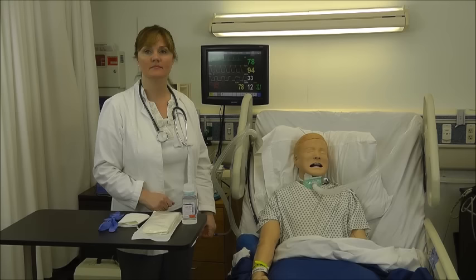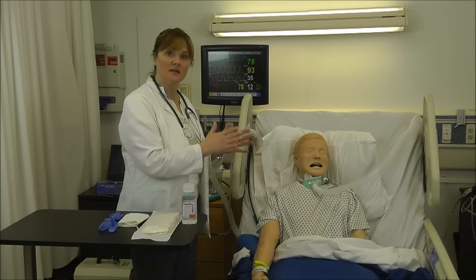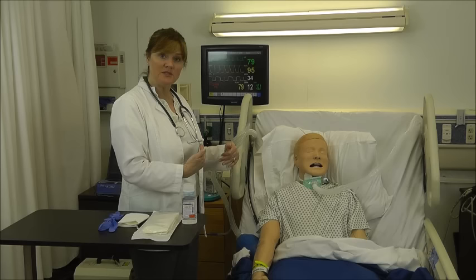allergies. I've provided for privacy by either closing the curtain or closing the door. And now I want to position the patient so that the bed is at a comfortable working height for myself and that he's in either semi-Fowler's to high Fowler's. If the patient's not conscious, you want them in a lateral position facing you.